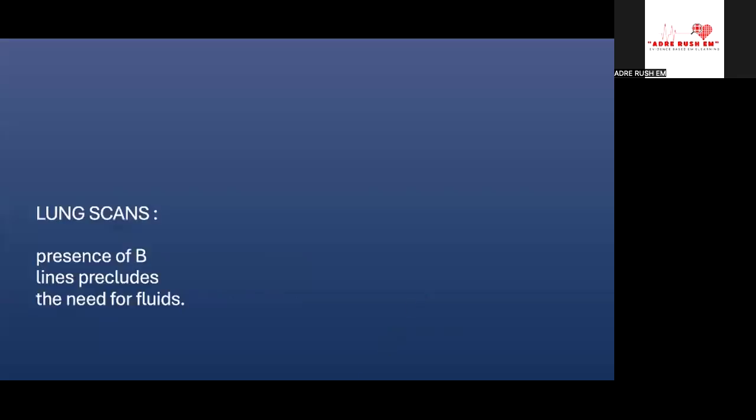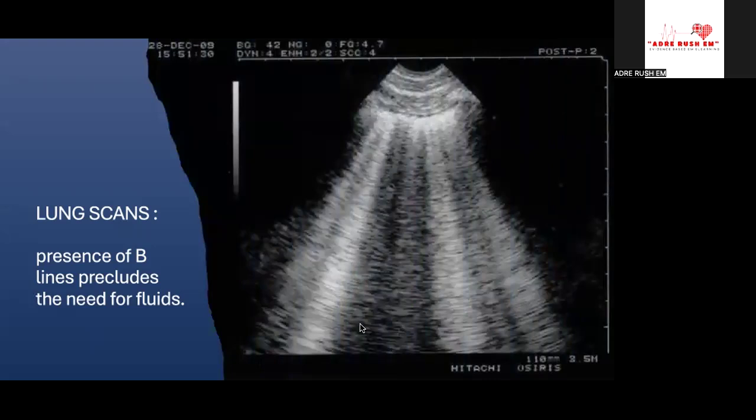Okay. Finally, to complement all of these findings, the lung scan can help you decide whether you have scope for fluid. That is, presence of B lines might preclude the need for fluids. As we all know, in critical care, this is not exclusively pulmonary edema.